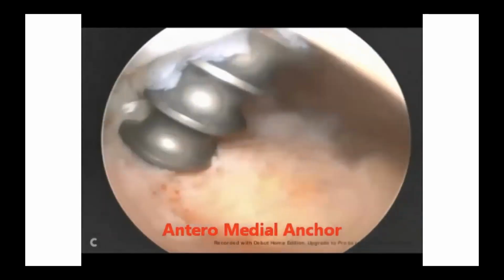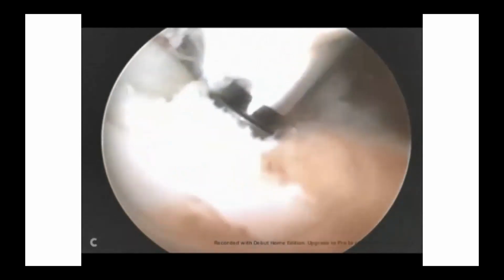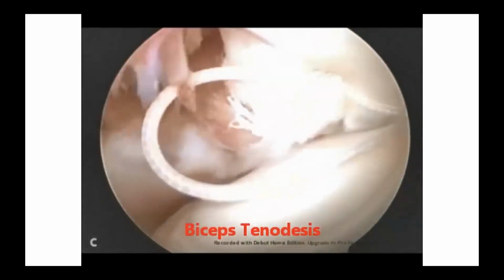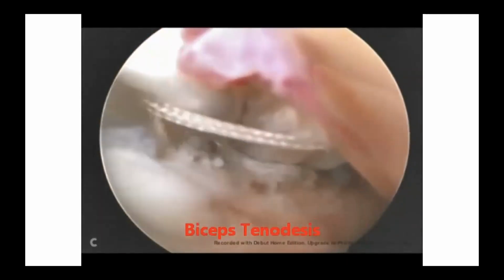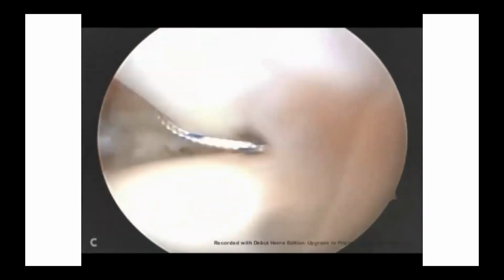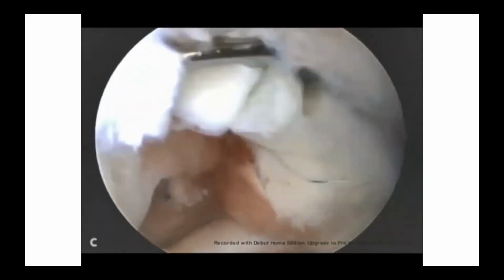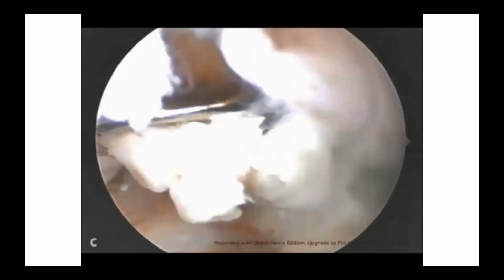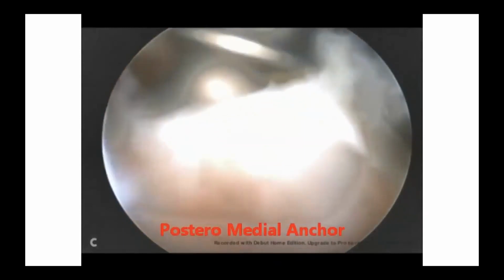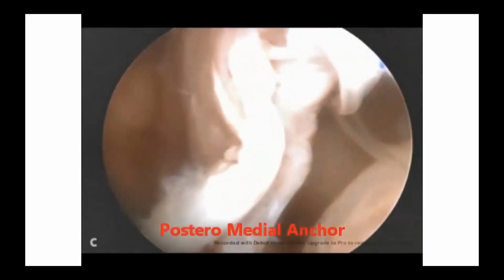Then application of the medial row anchors, starting with the anteromedial anchor, which is double loaded. Then using the suture passing instruments to penetrate the cuff together with the biceps, passing all four strands in a mattress fashion. Taking the biceps with the cuff and then inserting the posteromedial anchor 1 to 2 centimeters away from the anteromedial one.